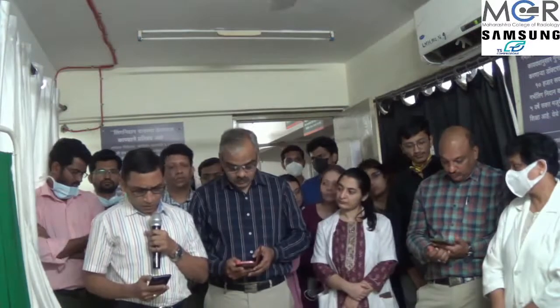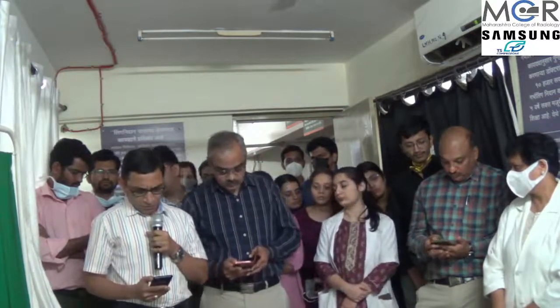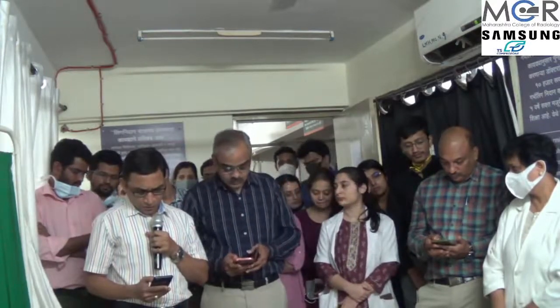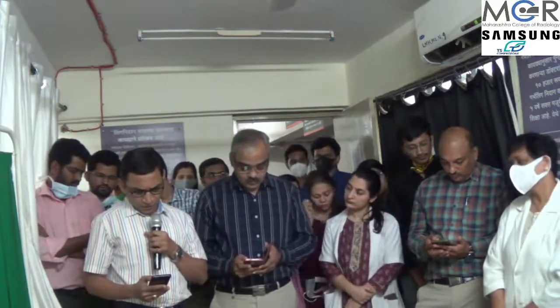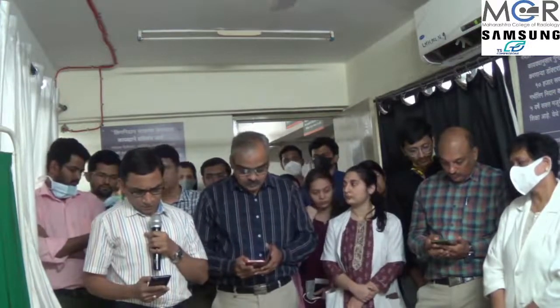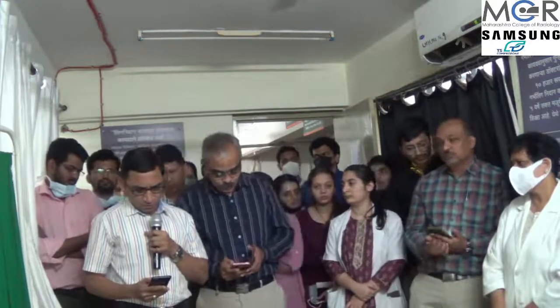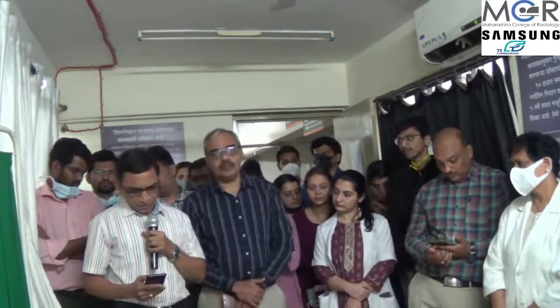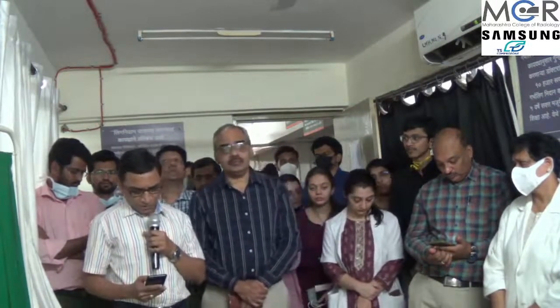Another question is, a case of a 22-year-old unmarried phenotypically female, but couldn't find her uterus well on USG. Only ovaries were seen, which are small in size. What to interpret? If you are doing a transabdominal sonography, what you see should be interpreted. So if you see the ovaries, interpret them depending on their appearance, and if the uterus is not visualized, you can mention that the uterus is not appreciated, and further evaluation in the form of MRI is a better choice.